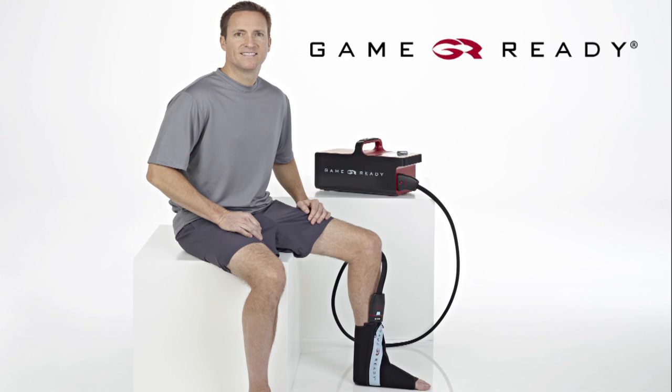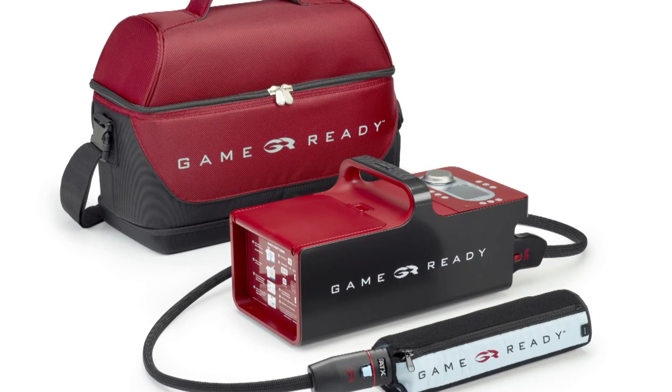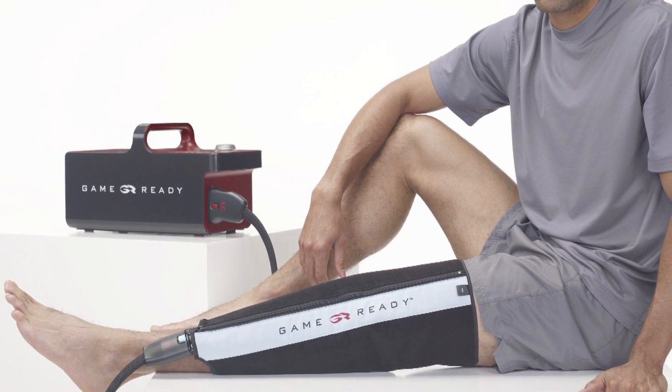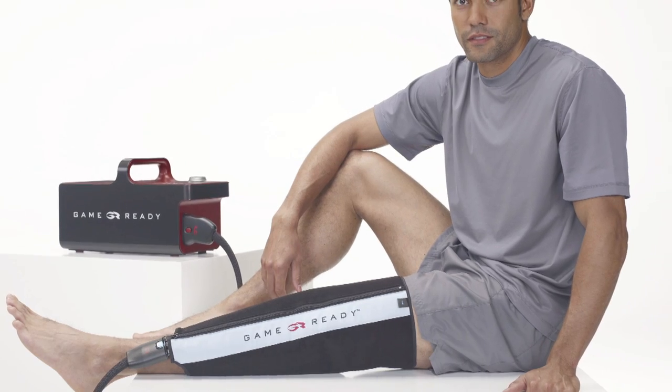Welcome to the GameReady Knee Wrap application video. GameReady uses AXEL technology to apply cold and active pneumatic compression therapy, designed to help you recover from your injury or surgery as quickly as possible. This video will demonstrate how to apply your knee wrap.